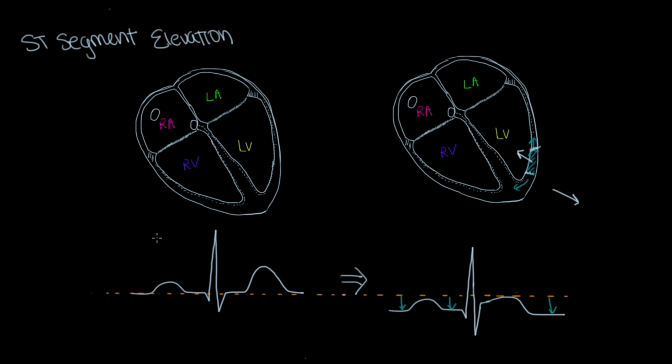But if we were to look at the normal heart and then look at the ECG here and trace how a full transmural infarction or ischemia would cause the ECG change, we would see that actually everything here gets depressed downwards, including the QRS signal here as well, and here as well, all depressed except for the ST segment, because that's when everything is depolarized and you can't really change anything about everything being depolarized.